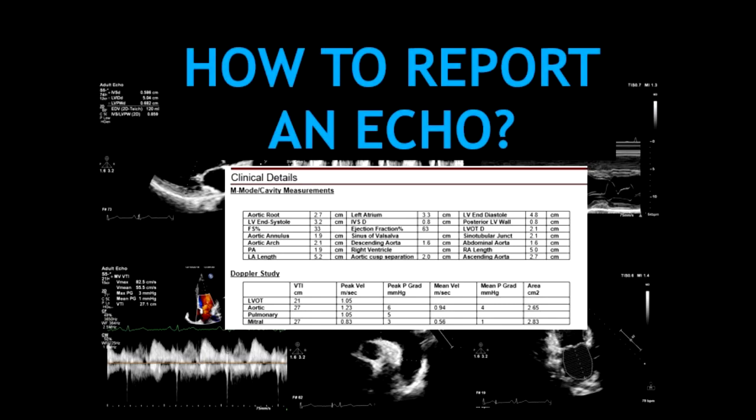Hello guys! In this video, I'm going to show you how to properly build an ECHO report. This is a highly requested video from all of you, so let's start.